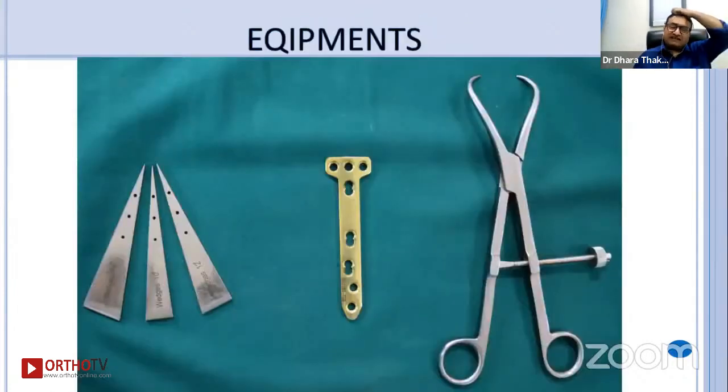Certain equipment is required. Nowadays we are always fixing, we are not giving plasters. First of all, these are wedges prepared for every degree. I have wedges starting from 6 degrees to 30 degrees, so whatever correction we want to achieve, we should have a wedge like this. Another thing is this plate, the TomoFix, which is now available in India from an Indian company also. And we require this patella holding clamp to hold the osteotomy properly.